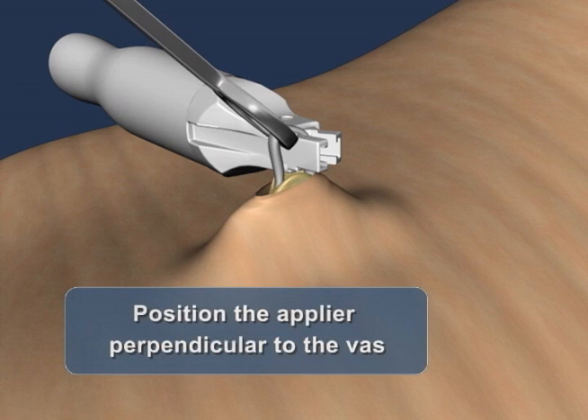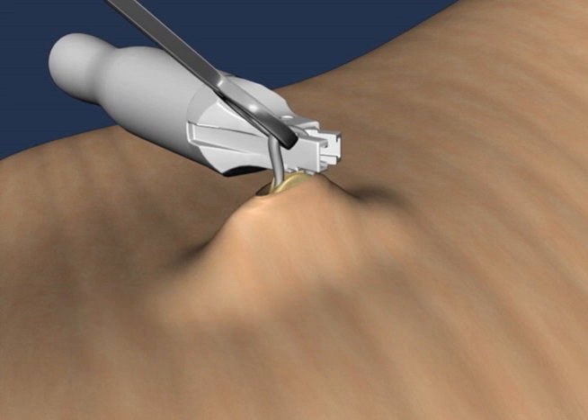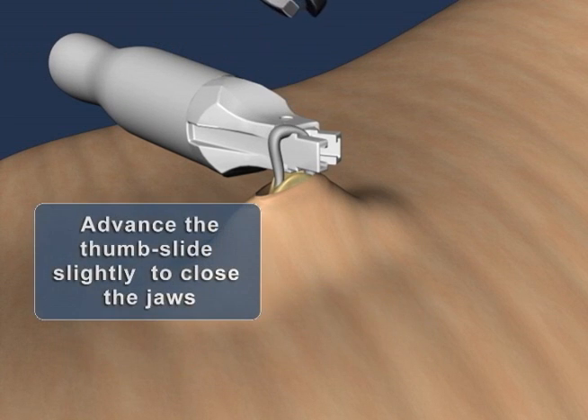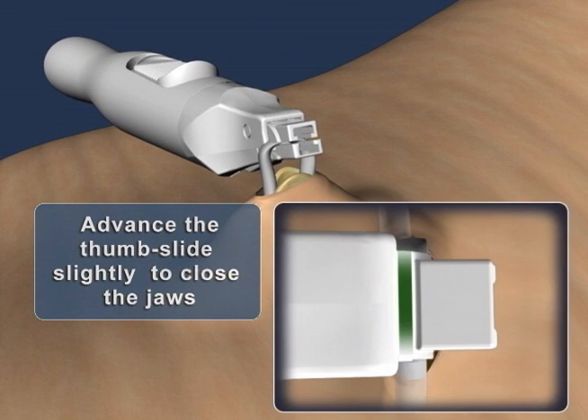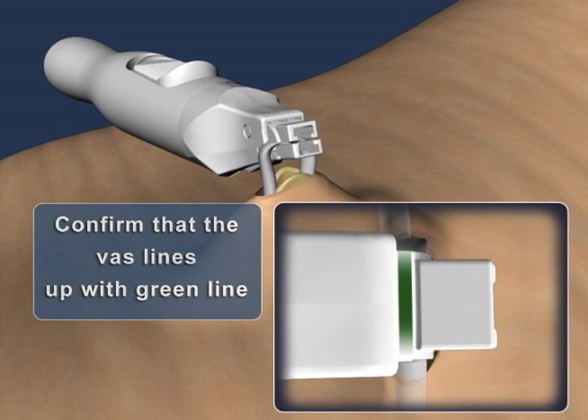Orient the applier perpendicular to the axis of the vas so that the clip will be applied at a right angle. Taking care not to deploy the clip, slide the thumb slide forward approximately 2 millimeters until a green line appears on the top of the applier. Note that only minimal pressure is applied to the vas by the spring-activated jaws during this process. Confirm that the vas lines up with the green line. If it does not, release the thumb slide and advance the applier forward to position the vas further into the jaws of the device.